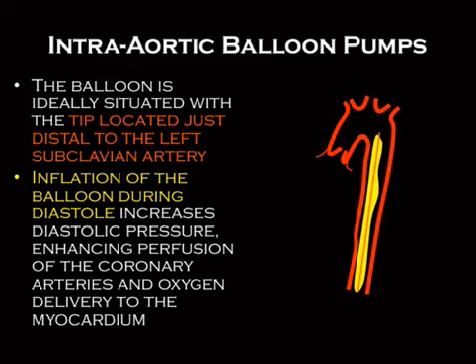So the way that these things work is they will inflate during diastole, and then as the blood goes through, it gets forced back into the coronary arteries and helps perfuse the heart.